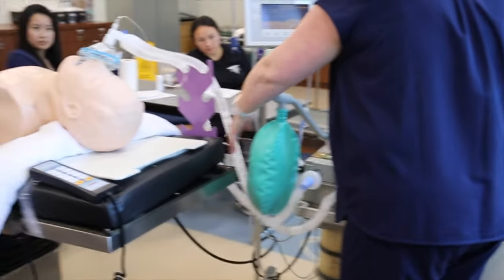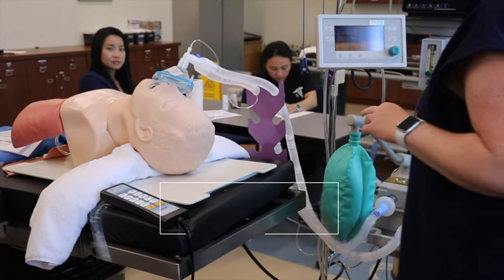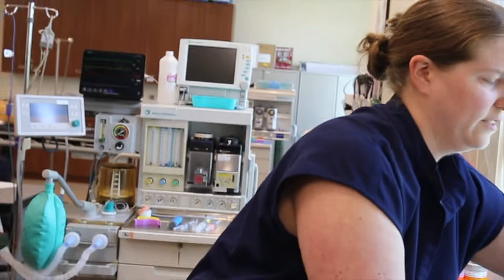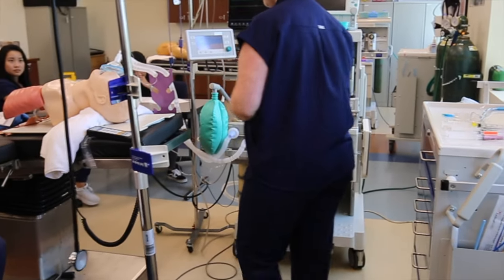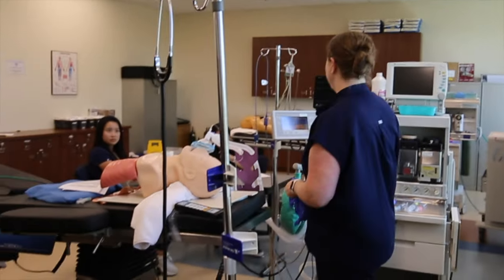All right. So I'll just do a run through for you guys. I will need an assistant to help me with intubation. On your rubric, there is something for infection control, you know, putting on eye goggles and care of contaminated equipment. You're welcome to put your dirty stuff in like a kidney basin. There's a million of them in one of those cabinets over there. Oh, there's one here.